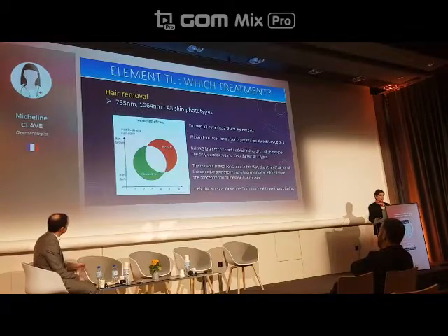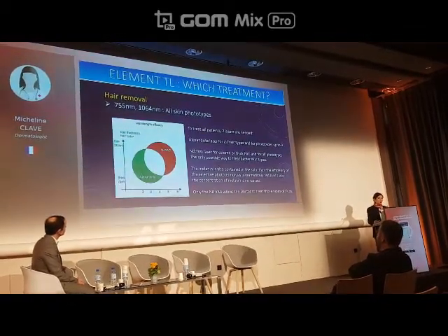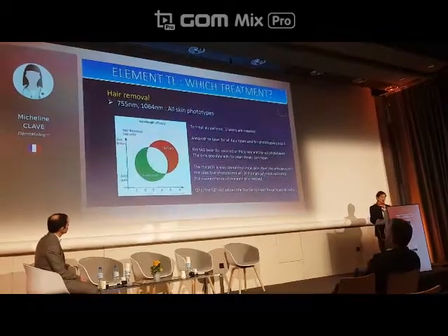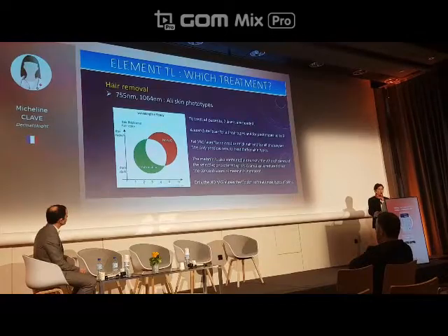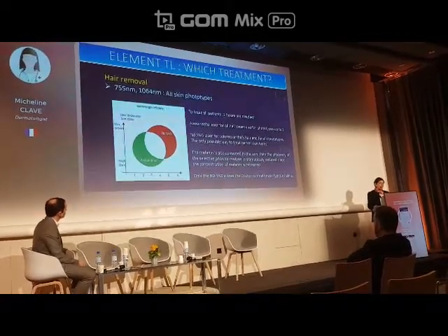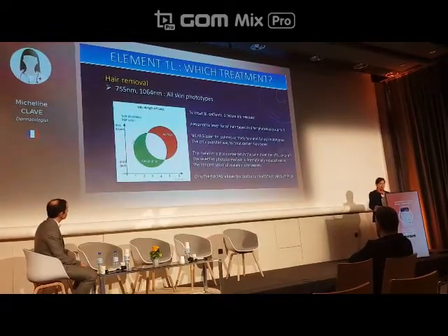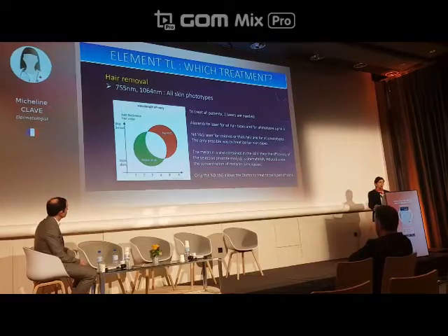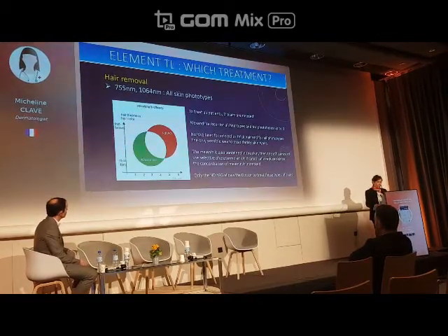For hair removal, you can treat all skin phototypes, because to treat all patients, you need 2 lasers. Alexandrite laser for all hair types and for phototypes up to 3. Nd:YAG laser for colored or thick hair and for all phototypes. It's the only possible way to treat darkened skin types.